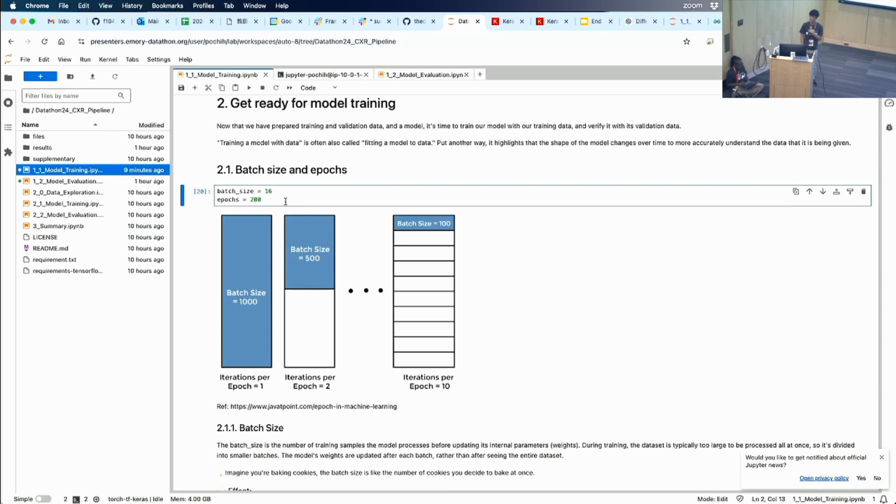Yes, there's a relationship, and for me, if I choose a larger batch size, then maybe my learning rate could be larger. Okay, because I will go through all the images, I calculate the loss, and then I try to adjust my weights so I can make a larger step because I'm quite sure the direction is correct.